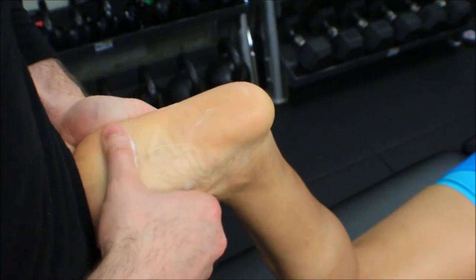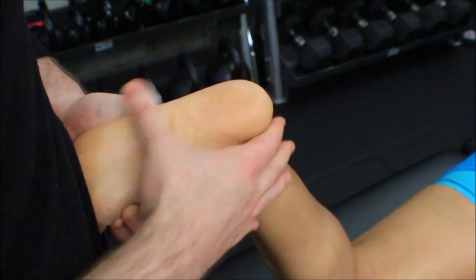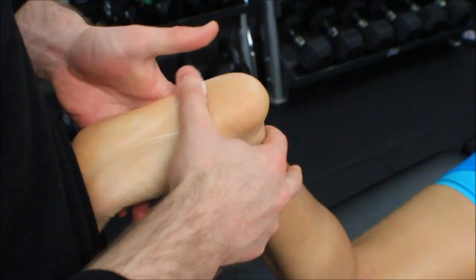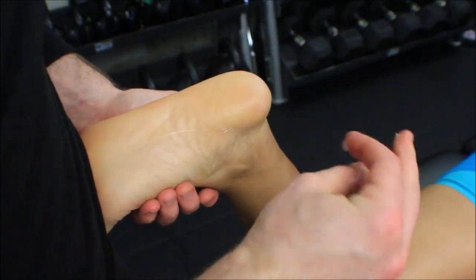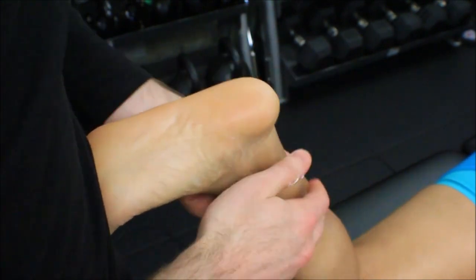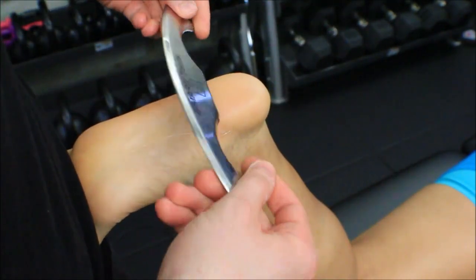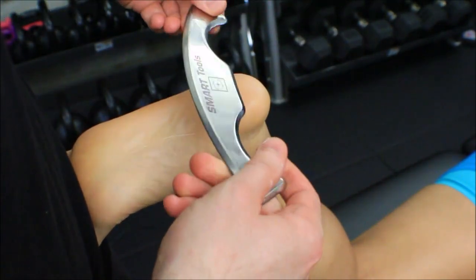You guys will notice that I have her foot stabilized against my stomach and the bottom of my rib cage here. Again, I used just a little too much cream, so we'll go ahead and moisturize Sonia's ankles here. That's okay. Then we're going to go ahead and use this batarang tool from Smart Tools.